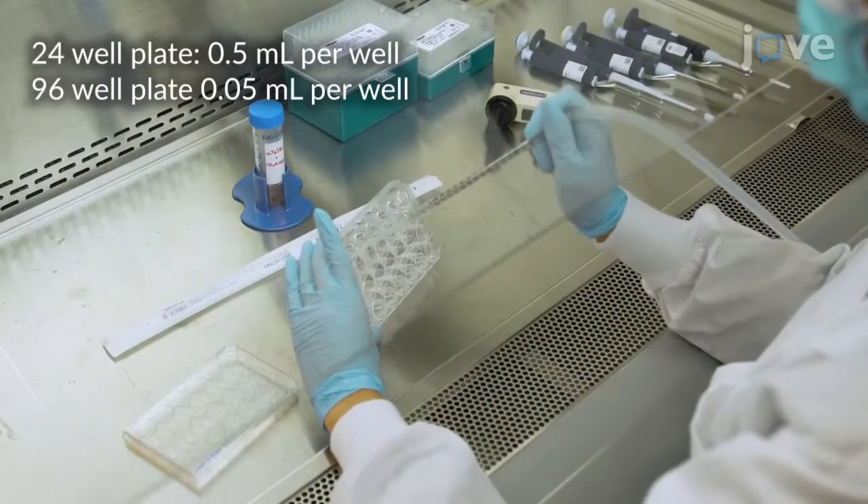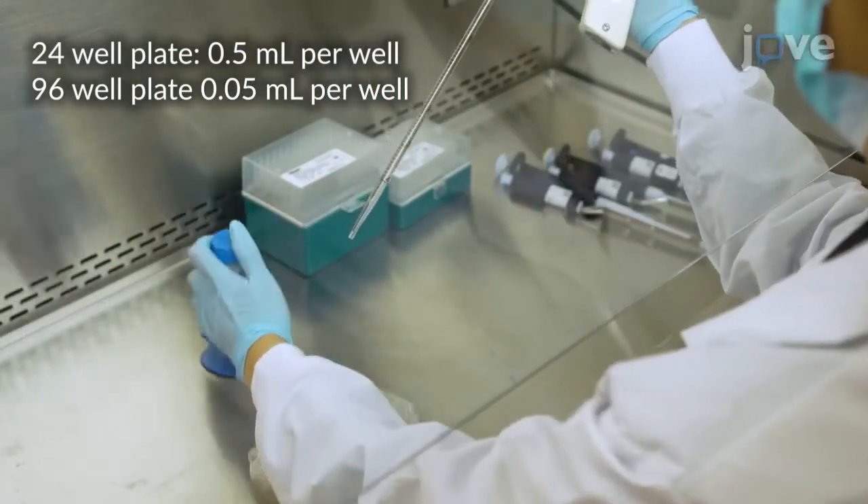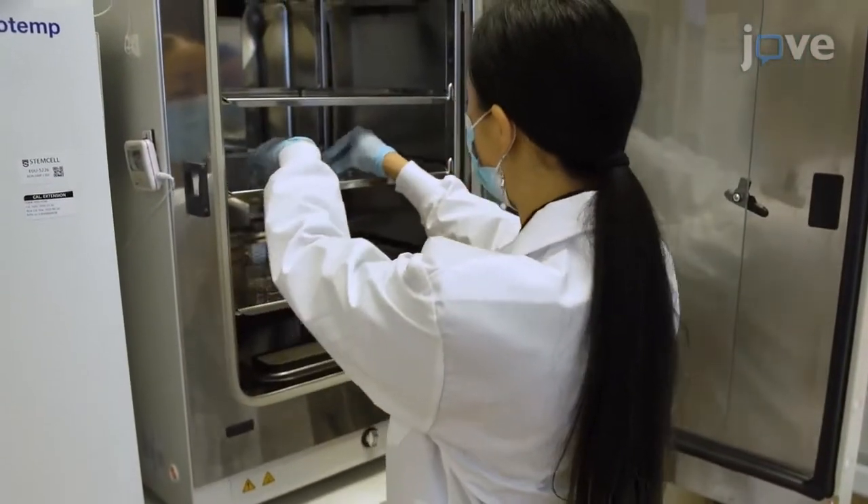Aspirate the laminin-521 solution and add stem cell maintenance medium supplemented with 10 micromolar ROCK inhibitor to each well. Then return the plate to the incubator.